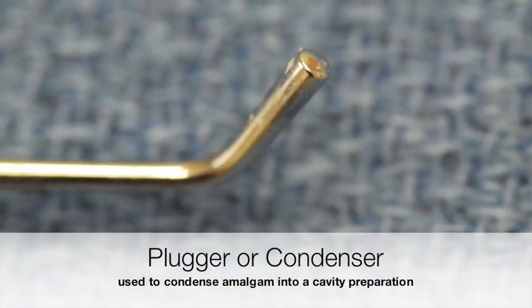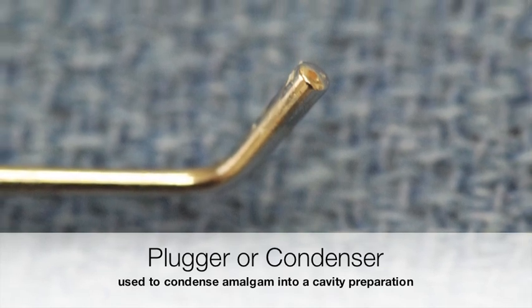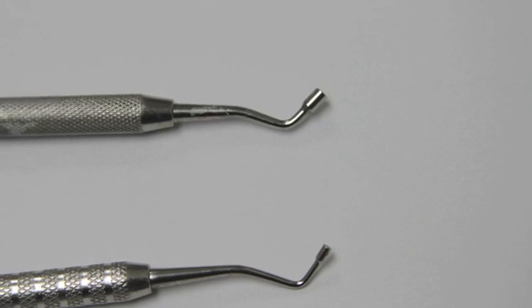This is an example of an amalgam plugger, also called a condenser, whose function it is to push or compress amalgam or even composite into a cavity preparation.